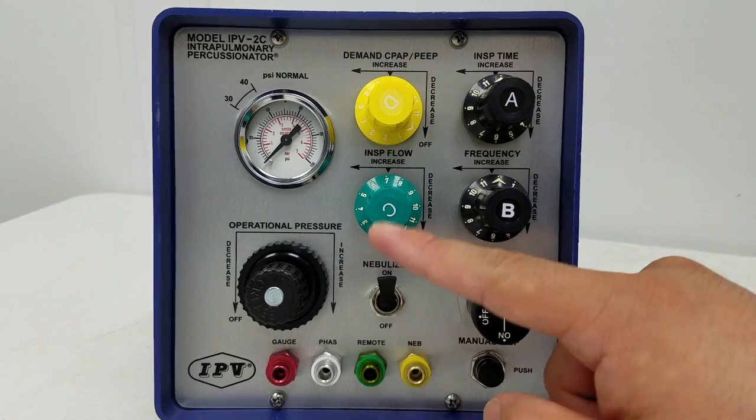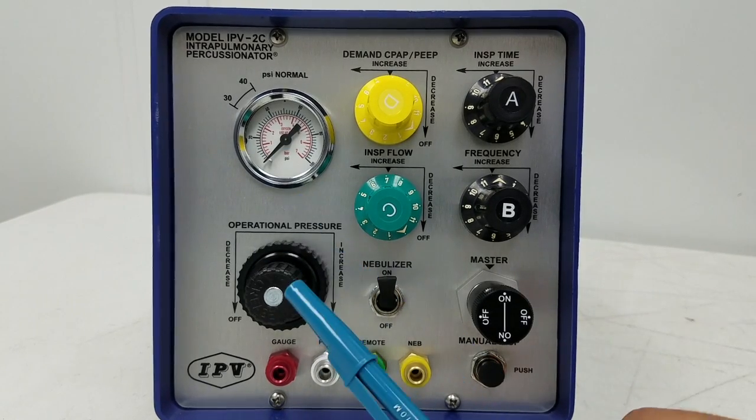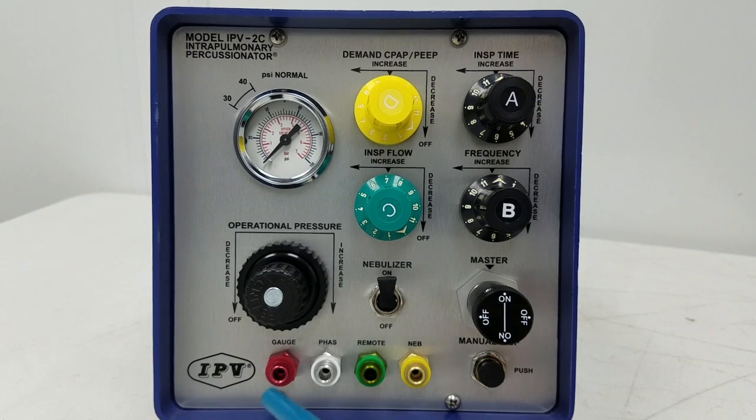You have your master switch at the bottom right. You have your nebulizer switch, which is always turned on whenever you're giving a treatment — you want the nebulizer running to provide sufficient humidification and aerosol. We talked about the operational pressure on the 2C, which I always have set to 40. Then you have your color-coded connectors for your circuit: red is for the gauge or pressure gauge, white is for the phase or phasotron which connects to the back of the circuit and creates the percussions, green is for the remote (not used too often), and yellow is for nebulization.